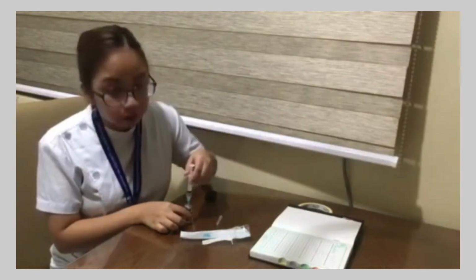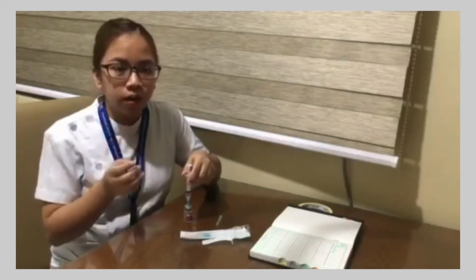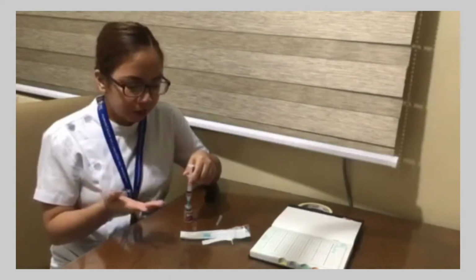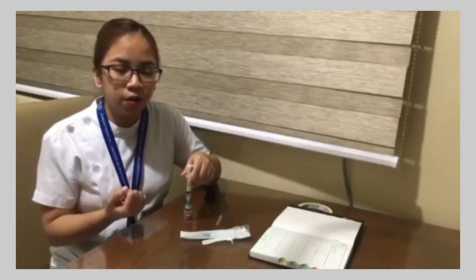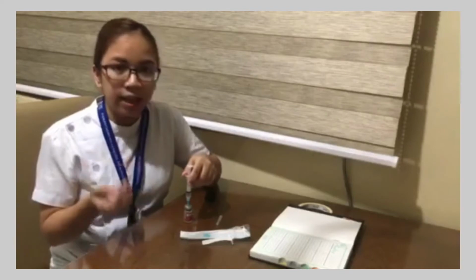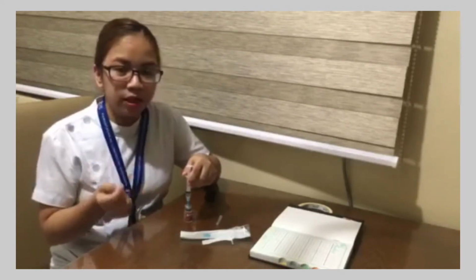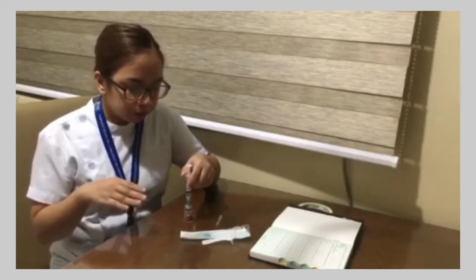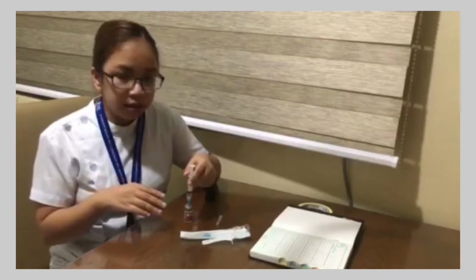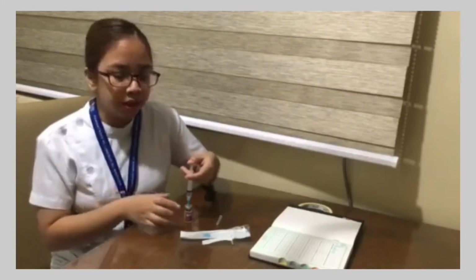Next, I'm going to inject the air inside the vial. This is for easily withdrawing the medication, because negative pressure will not build up inside the vial. Keep the bevel of the needle on the surface of the medication, to avoid creating bubbles inside the medication.